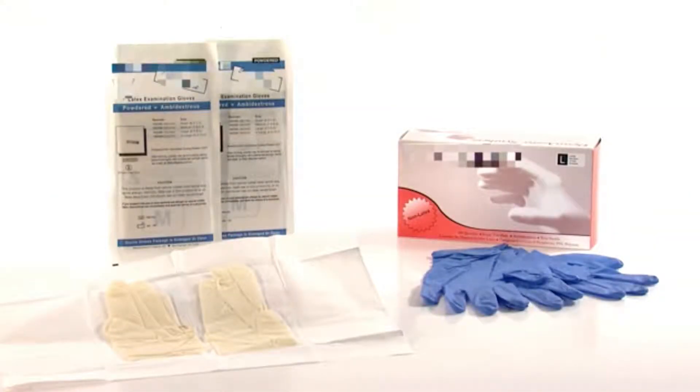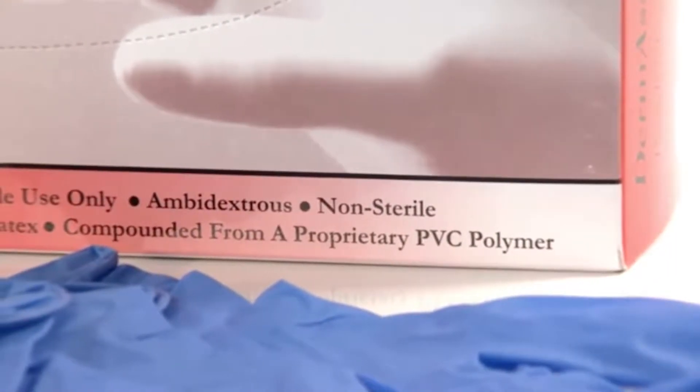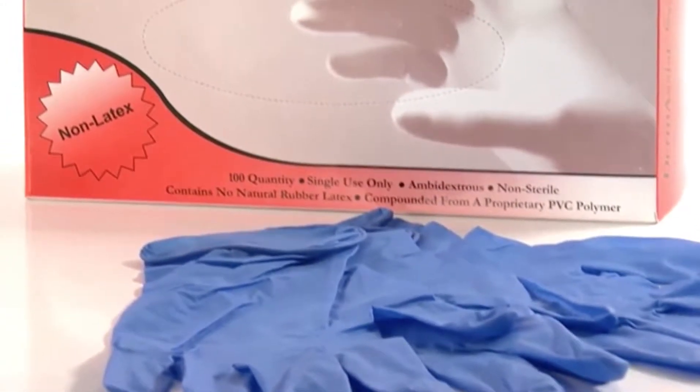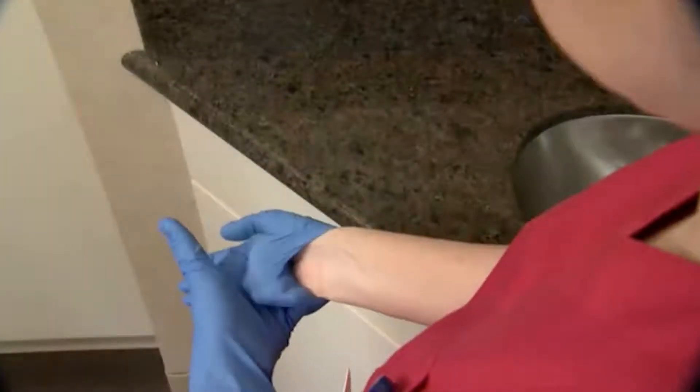Gloves are classified as clean or sterile. Sterile gloves are typically used for sterile procedures. Clean gloves are used for most other procedures requiring protection from blood, body fluids, and other contaminated items. This program will demonstrate the donning and removal of clean, non-sterile gloves.